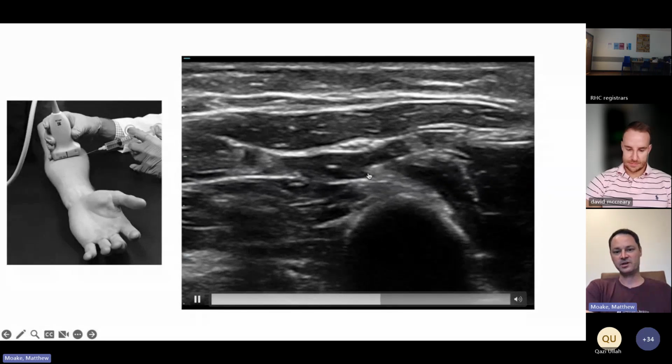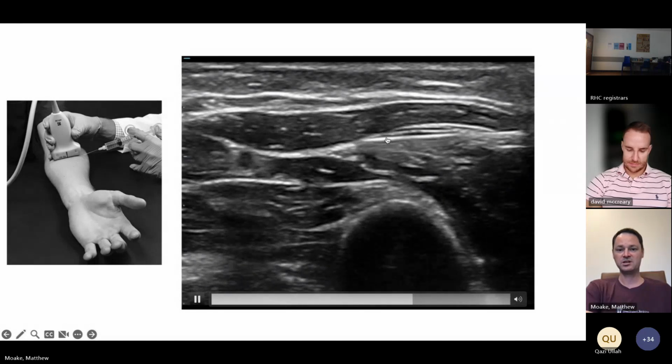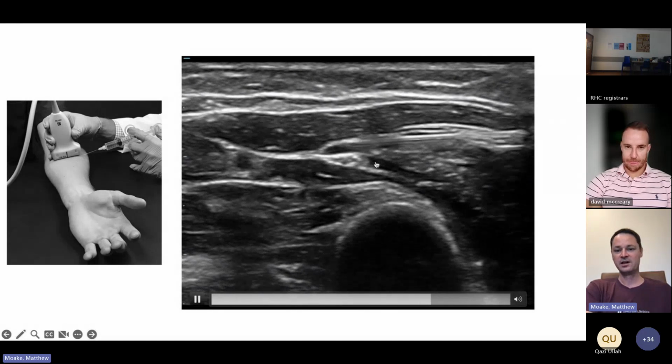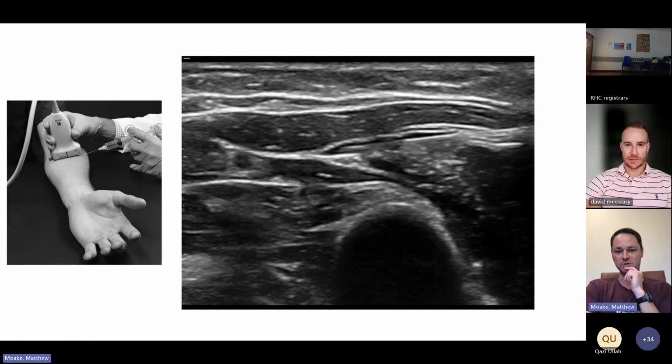And here in the back end of this one, they're going to adjust the needle a little bit and actually come in a little higher and hit this tissue plane. And when you hit that plane, it really unzips around the nerve. And that's that same concept of doing more of a fascial plane block as you hit that potential space around the nerve.